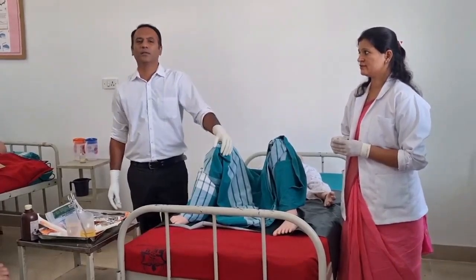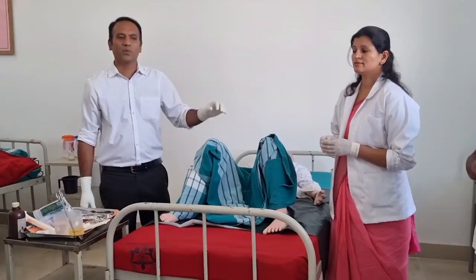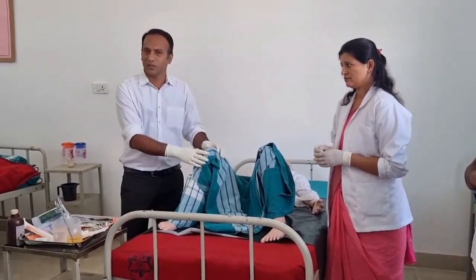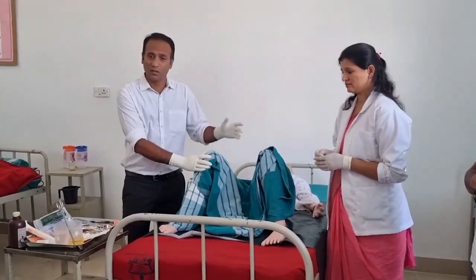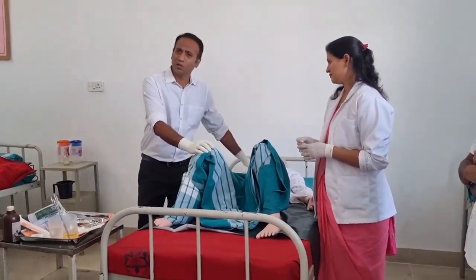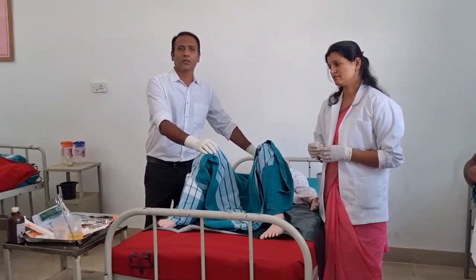The second point, applicable for almost all procedures, is to expose the minimum required area. It's not that I'm doing catheterization and removing all the clothes unnecessarily. We have used this cloth, or you can call it a bedsheet, for draping the areas. We prefer the dorsal recumbent position.